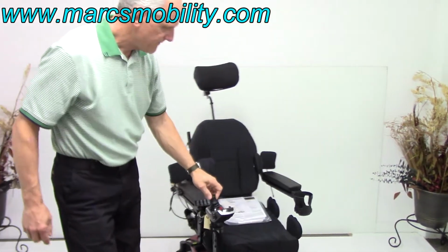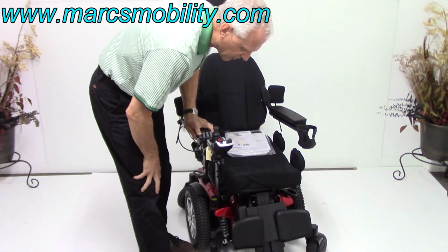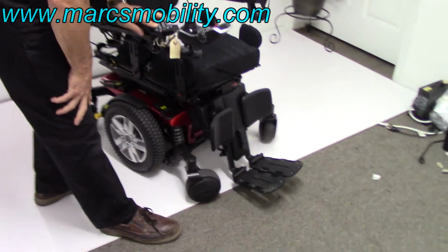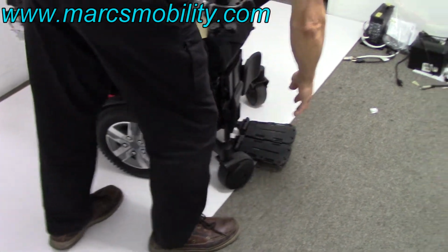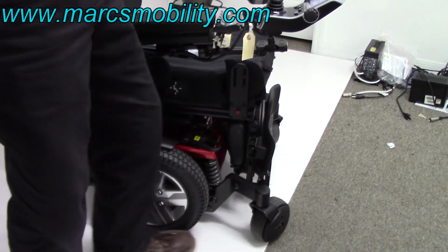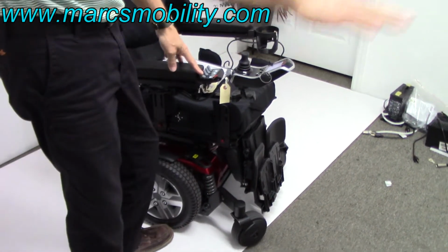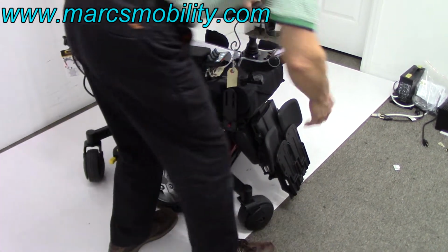The front of the chair, you've got a foot plate. If you want to bring these legs all the way under the chair, so when you get out, watch, I'm going to bring the legs all the way under the chair. And then if you flip up your foot plate, there's really nothing in front to obstruct you. When you drive the chair, make sure your legs are out. When you're outside, make sure they're out at least 20%, 30%. Give you more clearance under your foot plate.